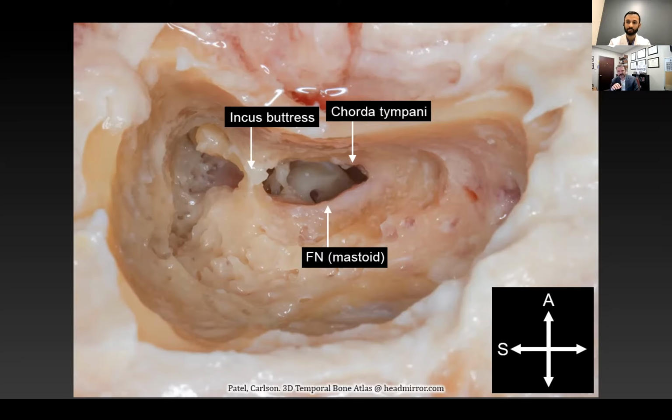The facial nerve in particular tends to have a couple of blood vessels over it, and they'll often be a little bit more lateral to it. So you're drilling down, you'll see these blood vessels. You're wondering if it's the facial nerve or not. I would treat it as a facial nerve unless you're very confident, but there are blood vessels that come with them.